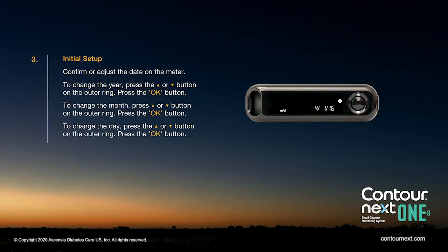Confirm or adjust the date on the meter. To change the month, press the up or down arrow button on the outer ring, then press the OK button. To change the day, press the up or down arrow button on the outer ring, then press the OK button.